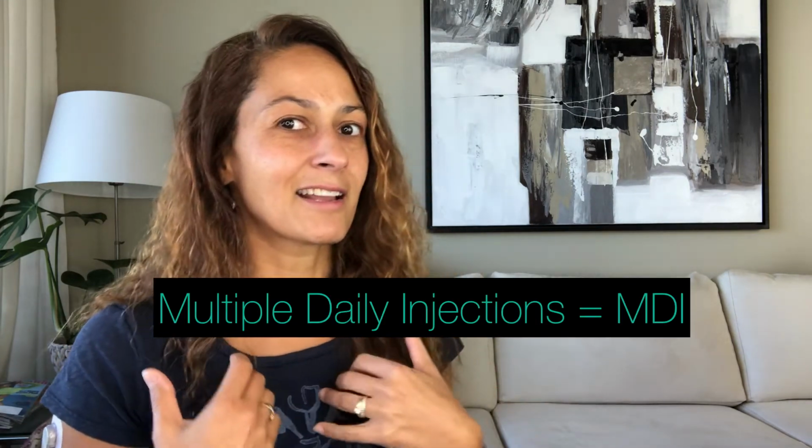So if you manage your diabetes with insulin pens and syringes, so multiple daily injections like I do, you probably know how hard it can be to remember when did you take your last dose, how much did you take, or even go through all of those calculations of figuring out how much insulin should you actually take for a meal or for correction. RapidCalc is a brilliant app to help you manage all of that.